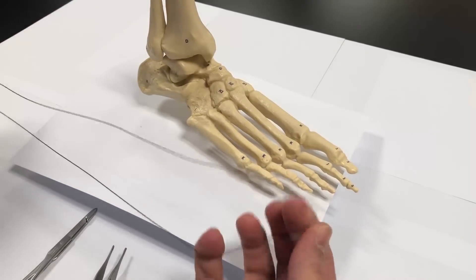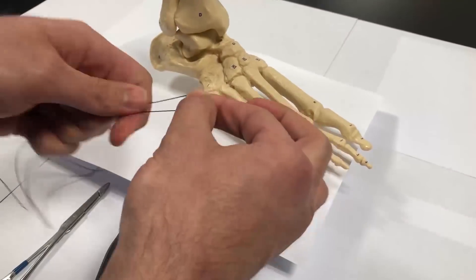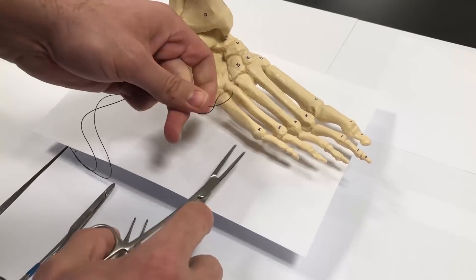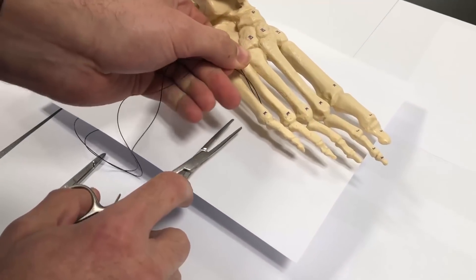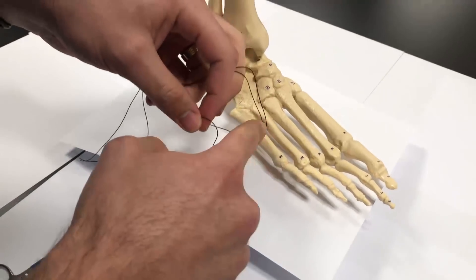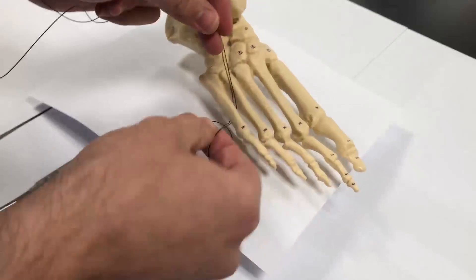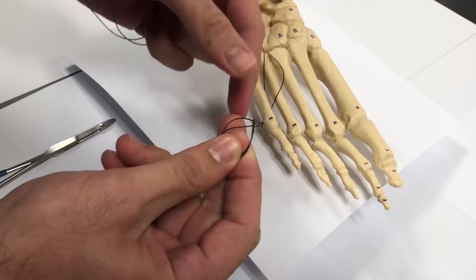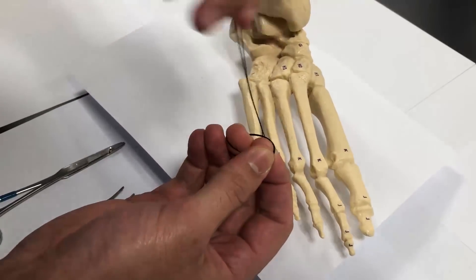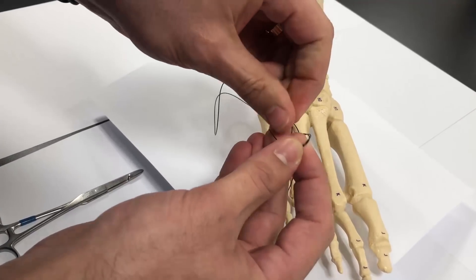You bring the two ends together like this. If you have a loop on this side, you take your loop and I like to use a 90-degree hemostat, but for these purposes a straight hemostat would be okay. You bring the loop in on one side, you grab it, pull it around. You take your loop and make this loop just like this, so it kind of looks like a lasso. You take your two ends and pass them through your lasso like so.